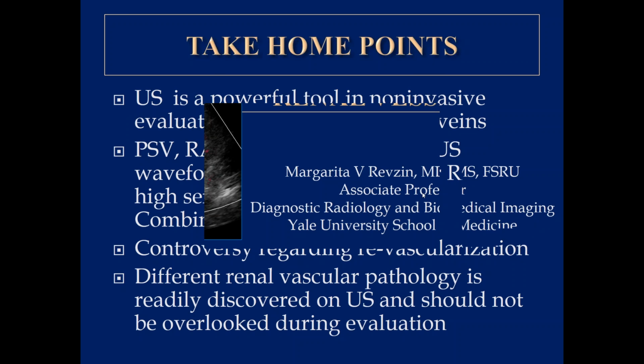And the last question is, if the kidney is less than 8 centimeters, do you still complete the renal artery stenosis exam? So I personally think that in the end you don't really need to complete the exam, depending on what kind of surgeon you're dealing with, because if the kidney is atrophic and less than 8 centimeters, then most likely it's not going to benefit from revascularization.